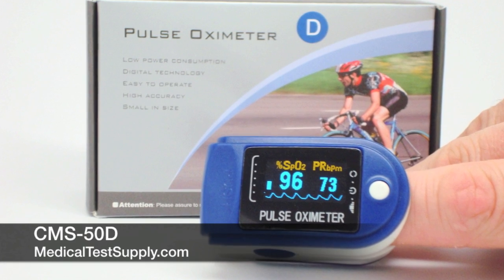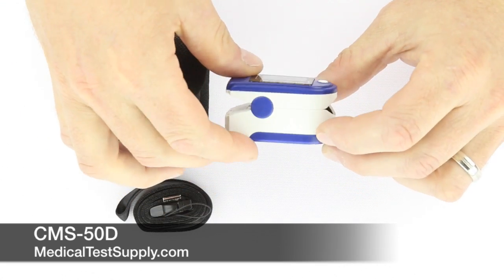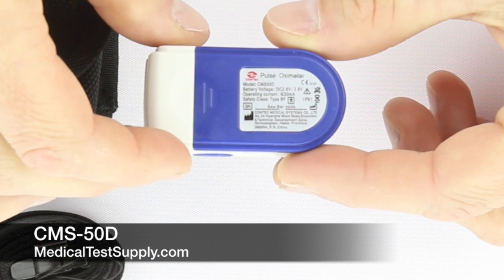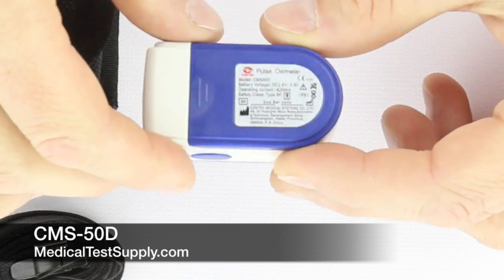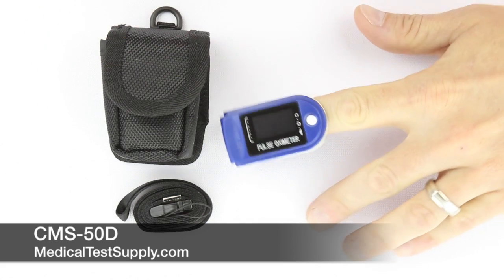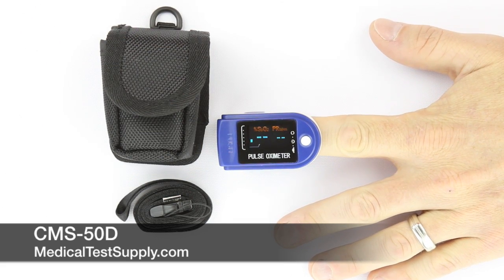The next product I'd like to illustrate is the CMS-50D. This product looks virtually the same as the DL previously shown; however, it utilizes an OLED display that is configured by the user. After inserting the finger, you will see the pulse strength bar and pulse rate waveform, confirming that adequate signal strength is available for proper readings.